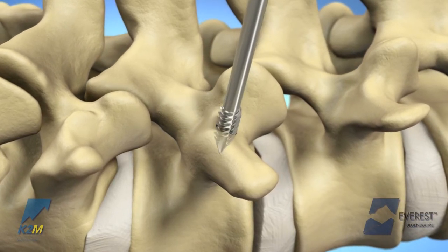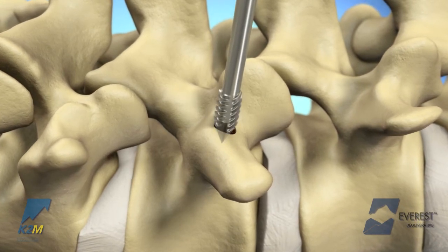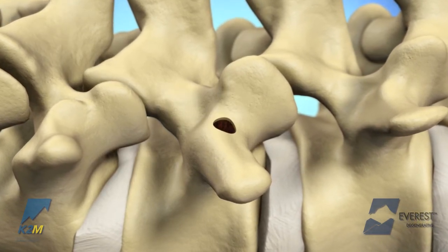The appropriate size tap should be used to prepare the pedicle screw pathway. Each tap is measured line to line with the corresponding screw diameter.